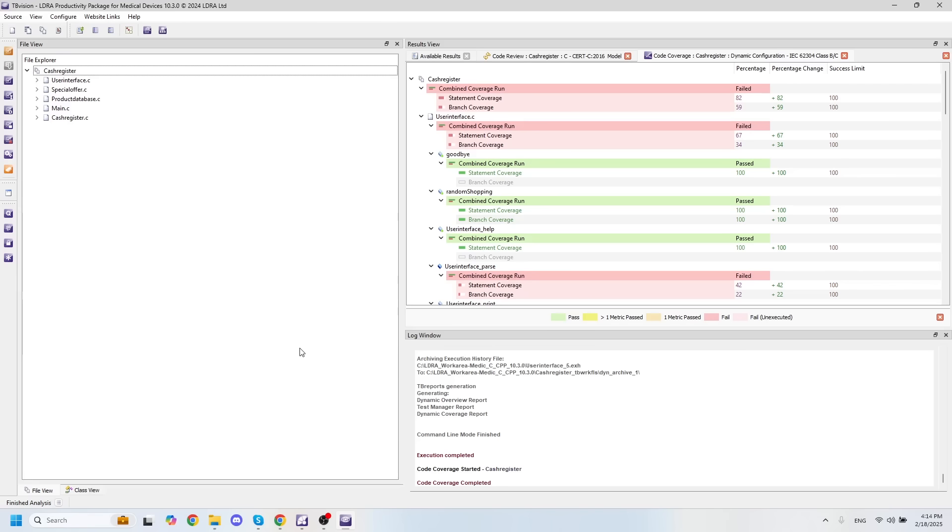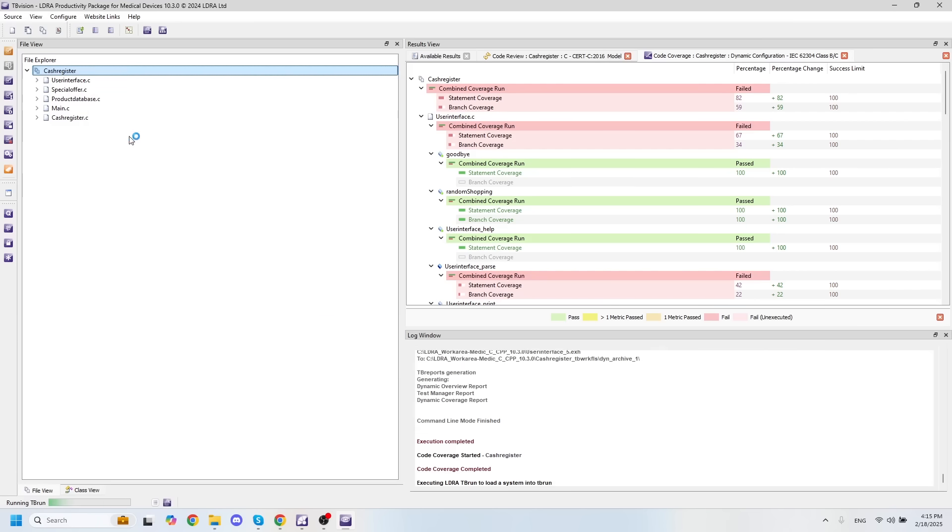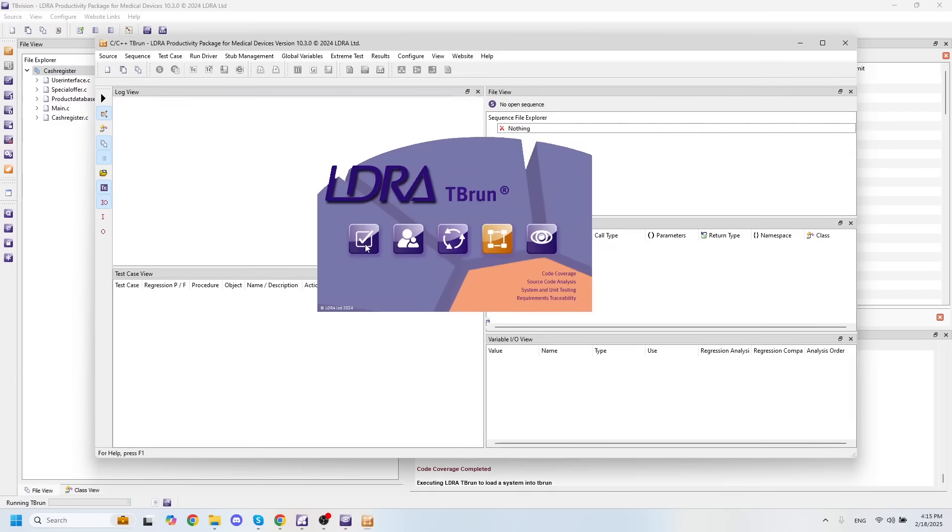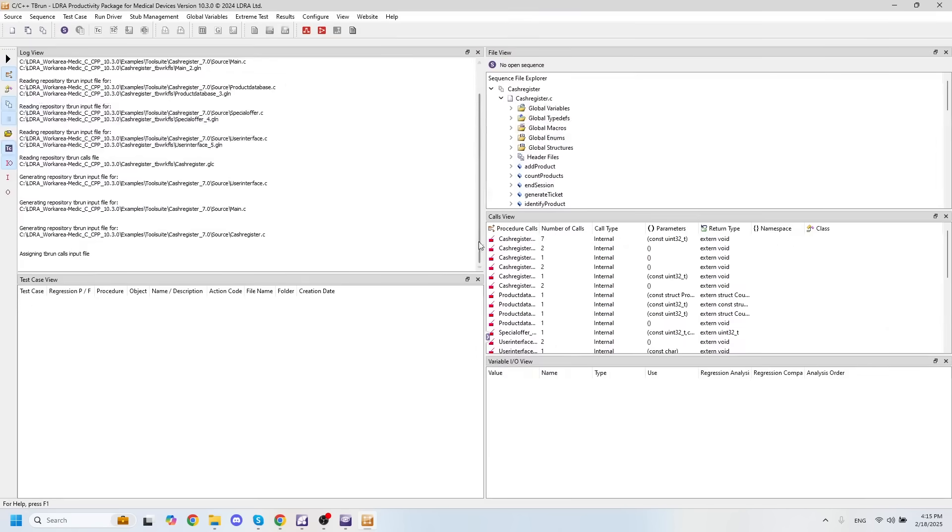And to do that, we can open up this same project in TB run, which is our unit testing software.